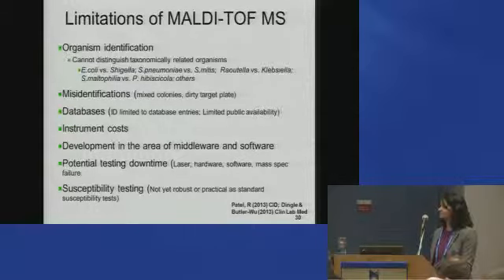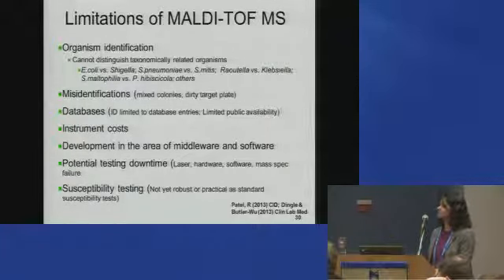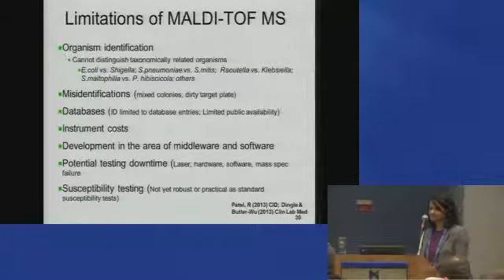And the other thing to keep in mind is potential testing downtime. So if your MALDI does go down for whatever reason, if somebody just forgot to close the hatch or didn't appropriately turn it off correctly, well, there's a big problem because the next person who's coming in to do MALDI is not a very happy person at that time, and that other person is not very popular. Because they did not shut the MALDI down correctly, or if the MALDI just goes down on its own, what are you going to do? Because there's so much riding on that one MALDI now that you really do need to make sure that you have really good service support. And in our situation, we ended up buying a second MALDI because we just feel there's so much riding on our first MALDI that we cannot imagine not having something to rely on.